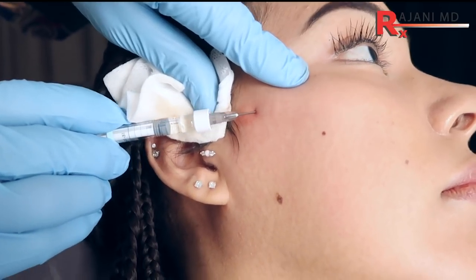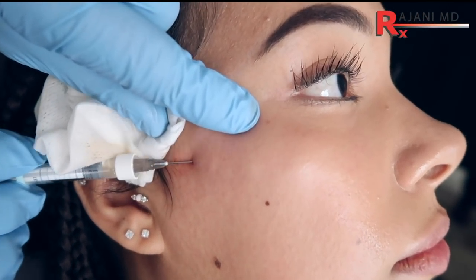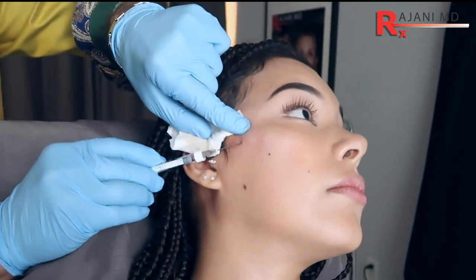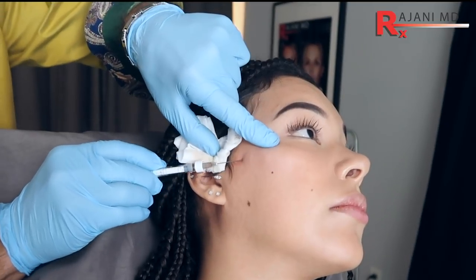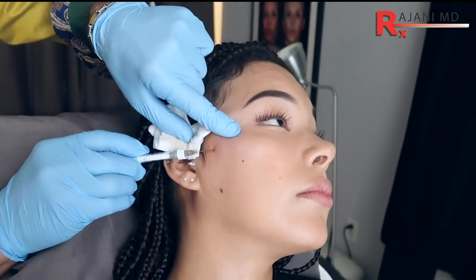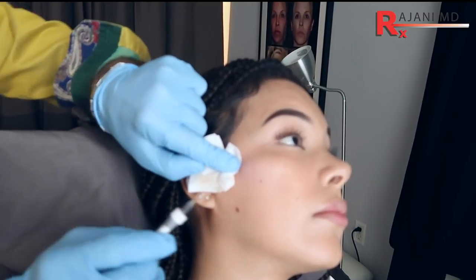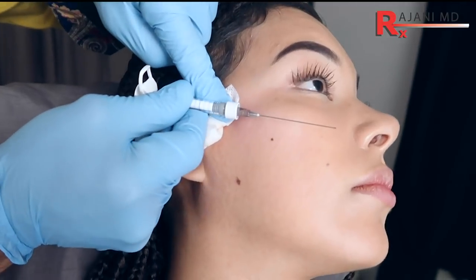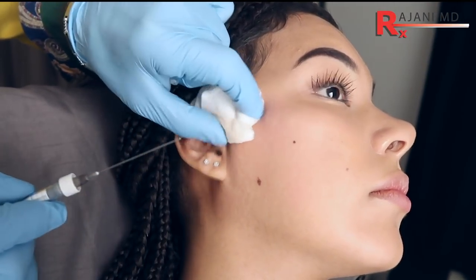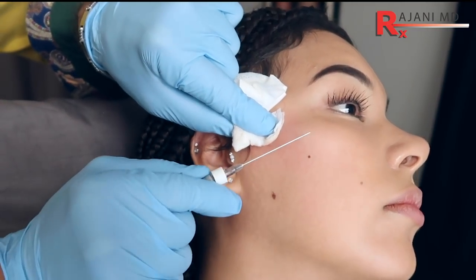Restylane Lift creates and holds a shape — it's a 900 micron size product. I'll create a high cheek; if she didn't like it after three to four days and wanted it more blunted and not so high — which is really rare — we could still mold that. So if it looks a little high when I'm done, I don't mind that, but I don't want it dull or nondescript because that's not beauty, and we can adjust it afterwards. There's a nice lift, and it's actually a very quick injection to do. I always hold a little bit of pressure. We want the hollow here — remember the parallel line from here to here — and I keep that high cheek. There's no need to massage; a little bit of swelling can be due to the cannula and that will come down, but I want that high apex.